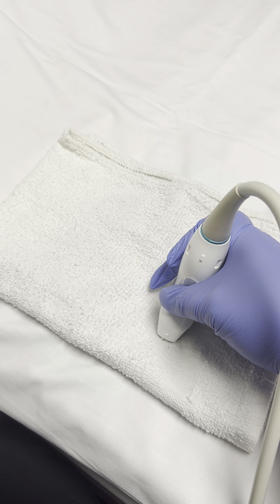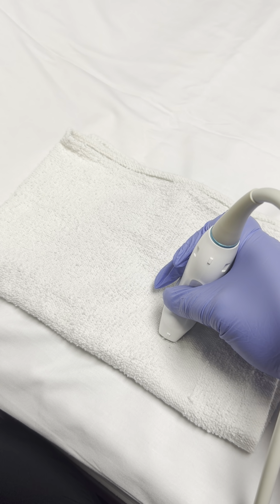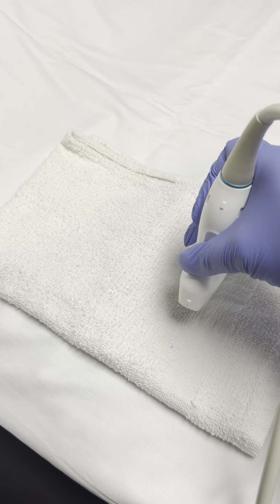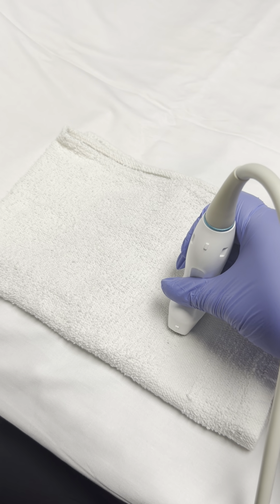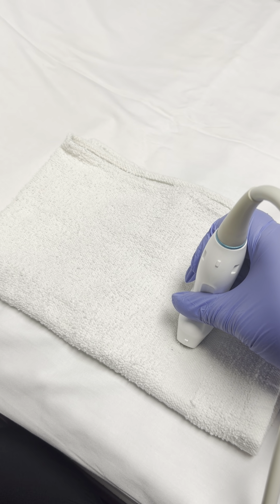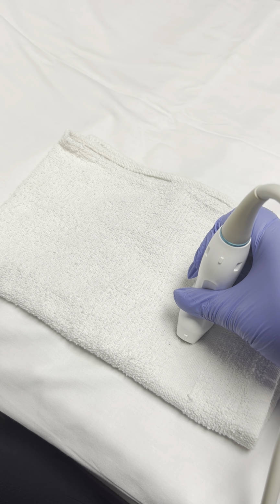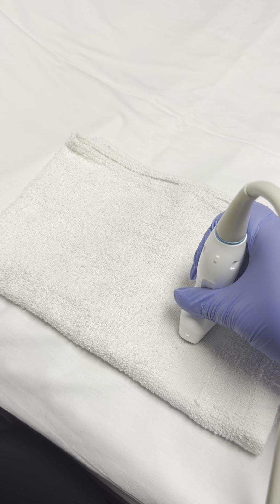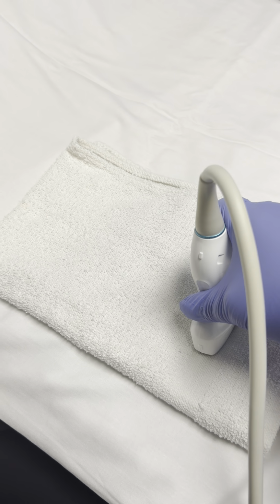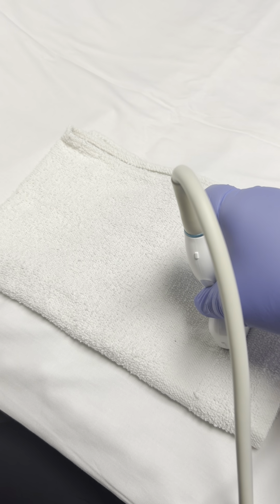Now we want to go through the standard heart sweep. You're still going to do that in a transverse plane. So you'll do it just like that in a transverse plane. And then as for the sweep, I start at the 4 chamber. And then from the 4 chamber, we're sweeping like this, towards the head.